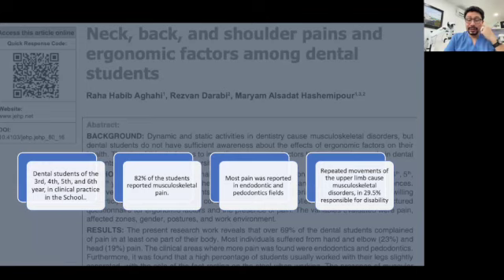I suffered that during the 4th, 5th, and 6th grade, and then I got into the endo school. And during the endo school, I started working with the microscope, and I noticed the change. It was more relaxing to work. I started feeling less pain in the area, and I really started enjoying my clinical practice. Before that, it was not fun for me.